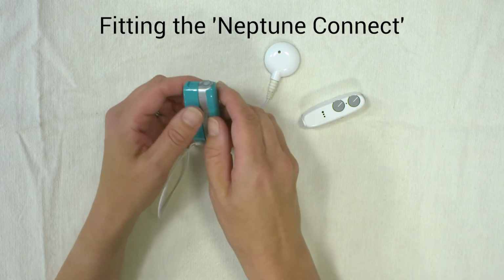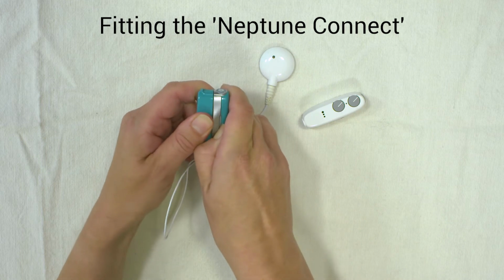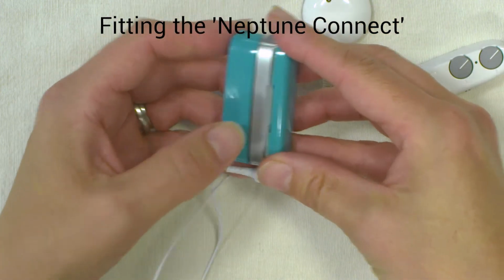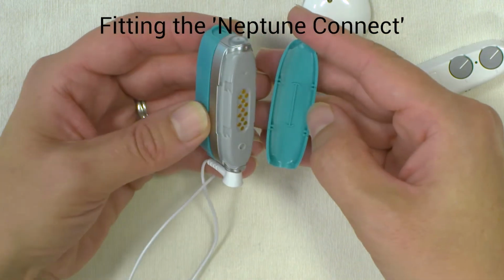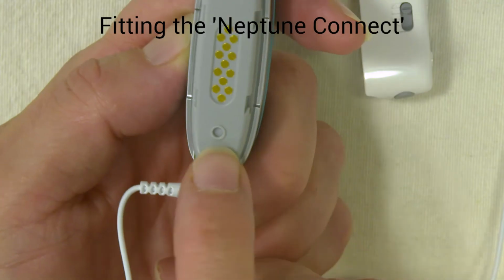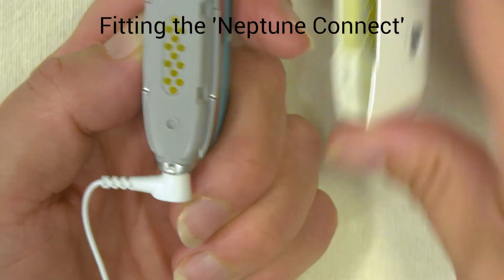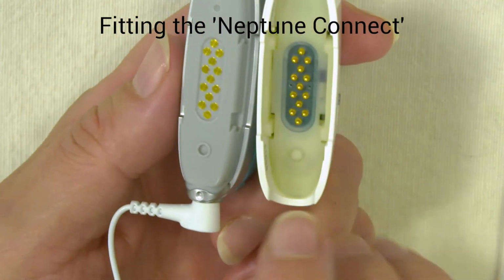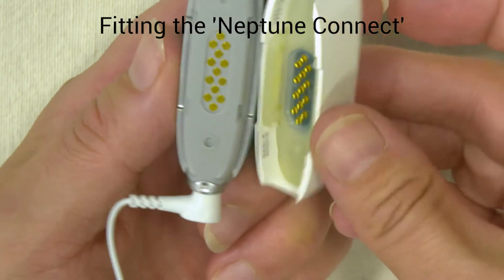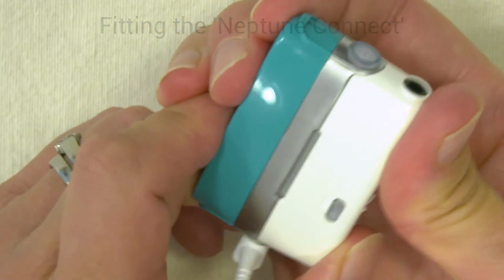In order to put it on, you need to take this side cover off. Again, using your nails, you can click it off. There are little gaps here to lever it off with. You've then got a little circular dip at one end, and on the connect you'll notice a little raised bump at one end. If you match those two up, you can then click the connect on.